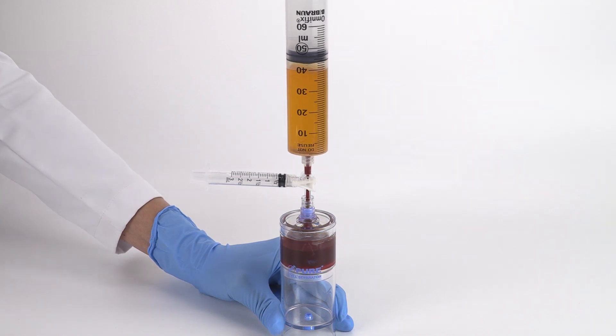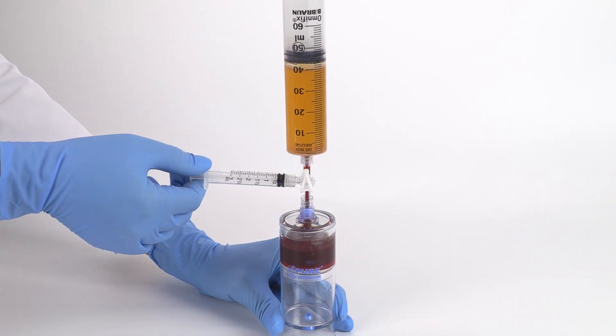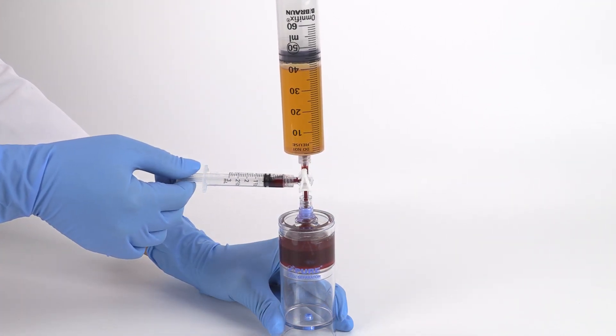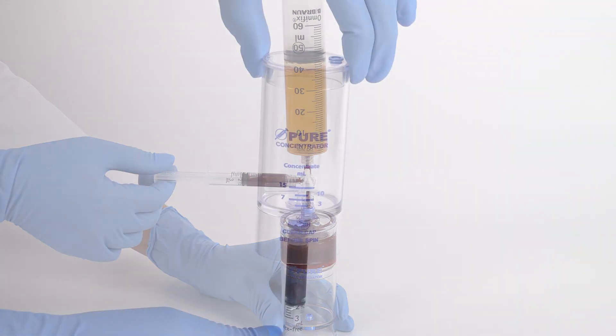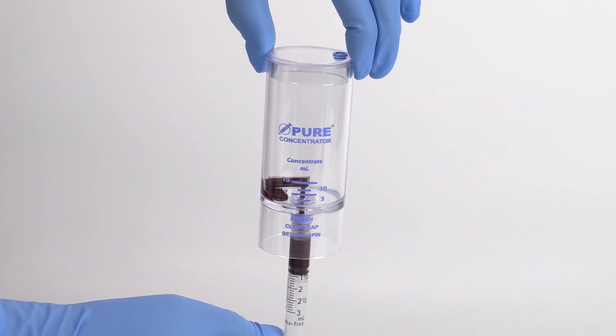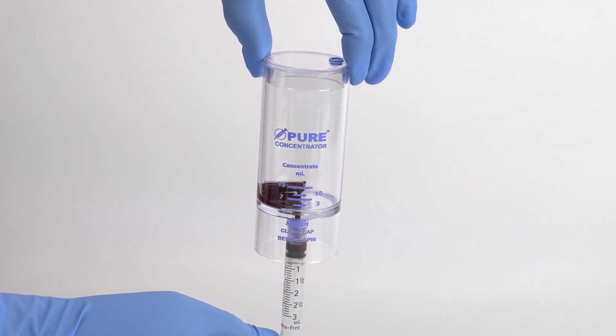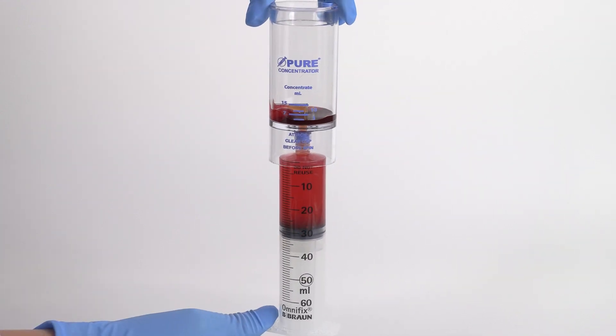Then open the stopcock to the 3 milliliter syringe and aspirate 2 milliliters of bone marrow red blood cells. Transfer the aspirated solution into the concentrator device as shown — inject the bone marrow red blood cells first, then the bone marrow plasma suspension.